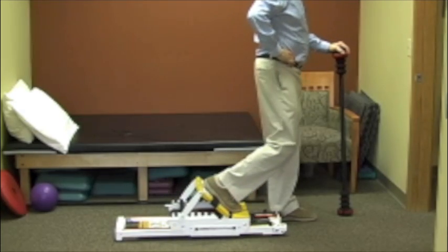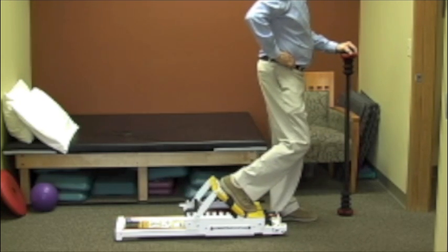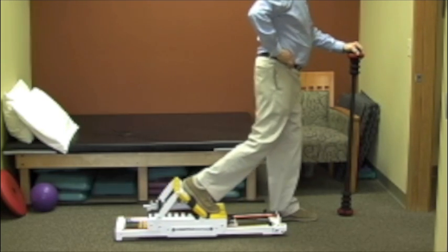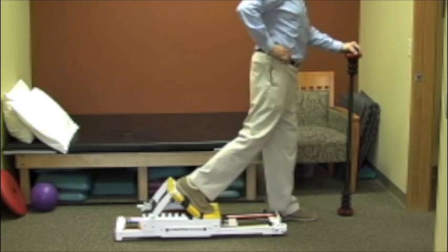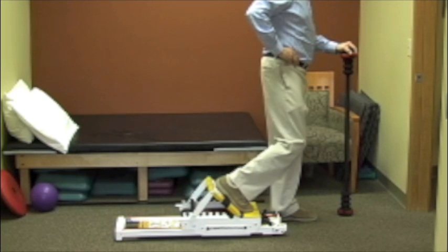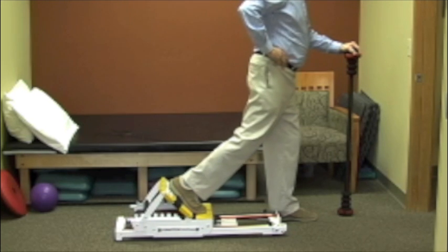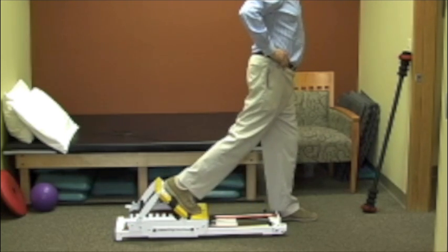We can position the Mini Press on the floor and give the client some support, whether it's with a piece of doweling or a weighted bar. He is working on hip extension with resistance. Even though he is pushing with his right lower extremity, his left lower extremity — his stance leg — is actually working almost as hard to maintain upright position. To increase the challenge, you can take away the staff he's holding onto and force him to use his balance and proprioceptors to maintain upright position.